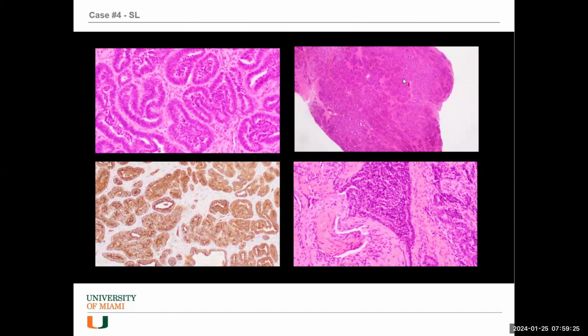I mean, the glands themselves, they don't look high grade. And that sometimes happens in carcinomas. The question is, where is this coming from? It wasn't very clear to the pathologist at that time to define a likely primary focus for this particular lesion. It looks like a carcinoma, adenocarcinoma to begin with, to be more specific. And it kind of looks out of nowhere, adenocarcinoma. The patient does not have, as far as I know, a primary focus anywhere, right?